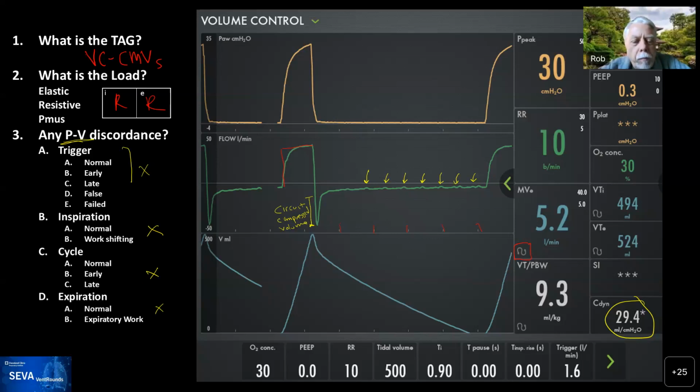Now, we're going to talk a little more about our strategies for ventilating these patients, but we're going to show that the auto PEEP on these patients is directly related to the expiratory time. So if you increase the respiratory rate, which is an urge that many clinicians have when they see such an elevated CO2, that will lead to more air trapping, which will lead to lower compliance and even worsening V/Q matching, which was the case on this patient.